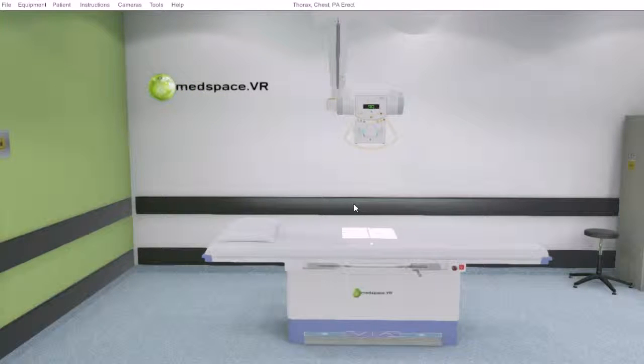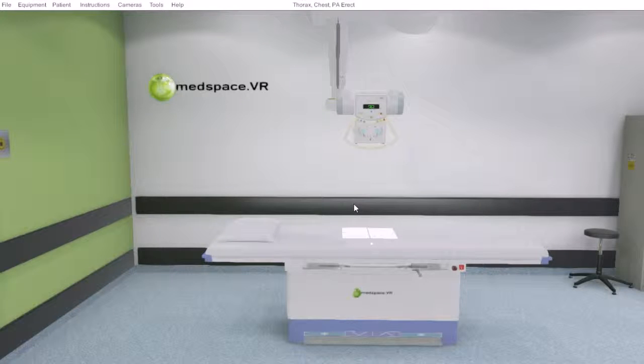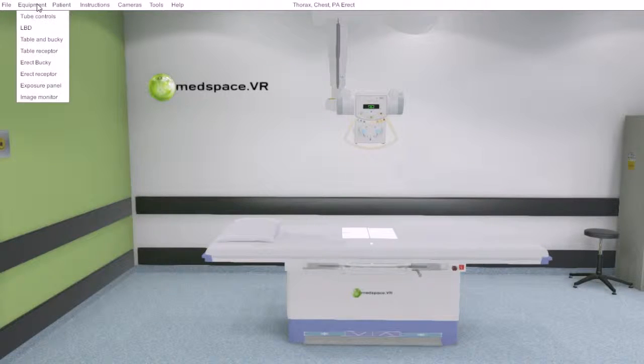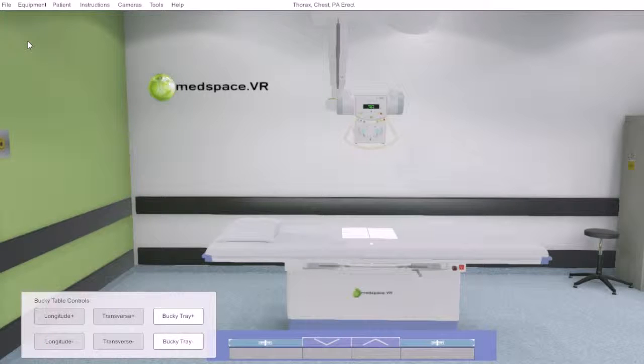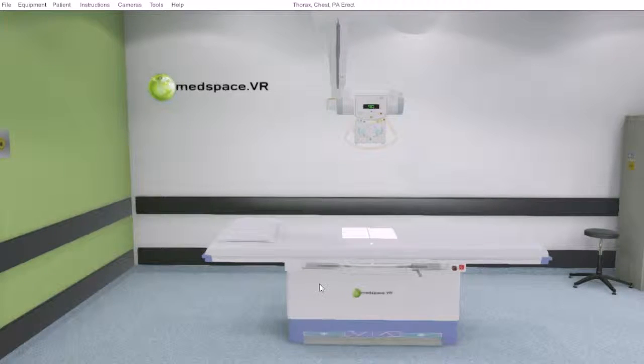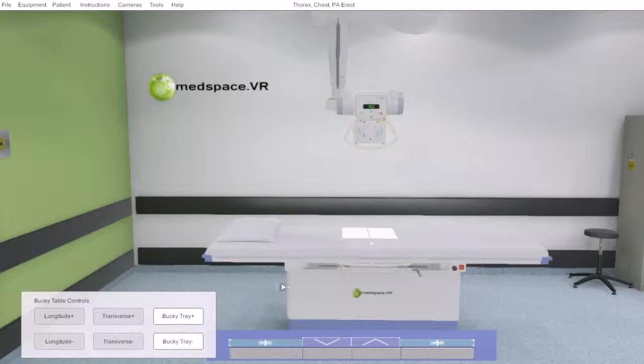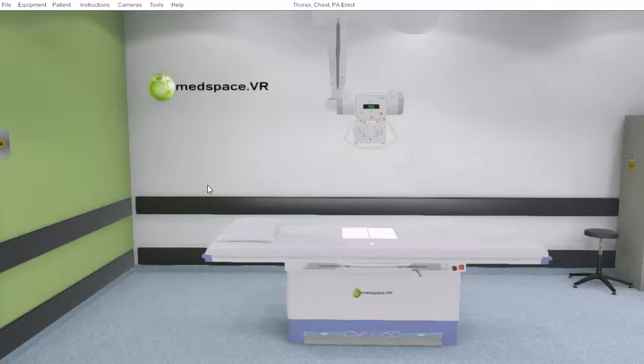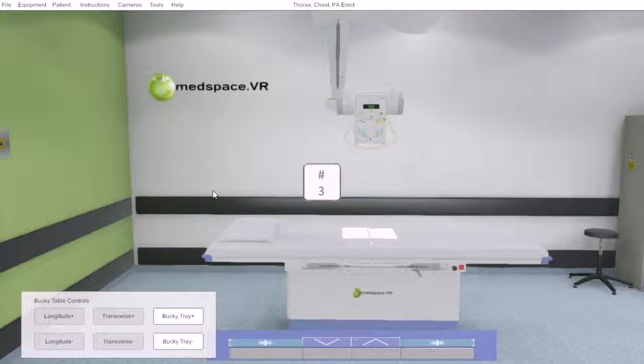In this tutorial we will be covering using the table and erect buckies. To interact with the table, in the equipment menu we can access table and bucky, or we can click on the table, or numerical key 3 will bring up the same menu.